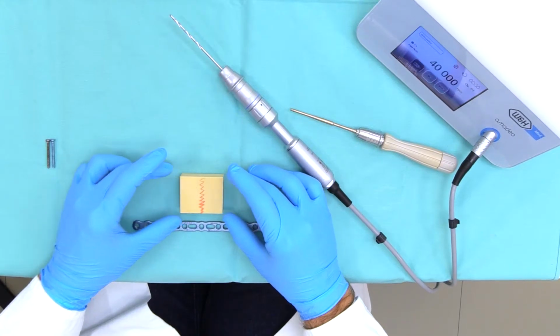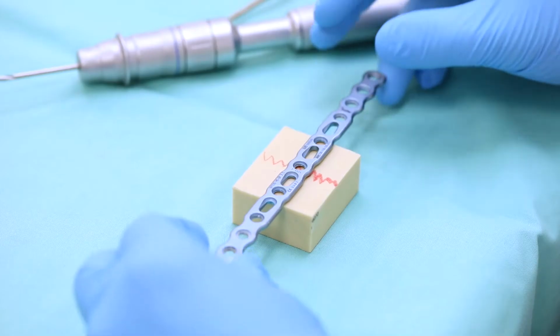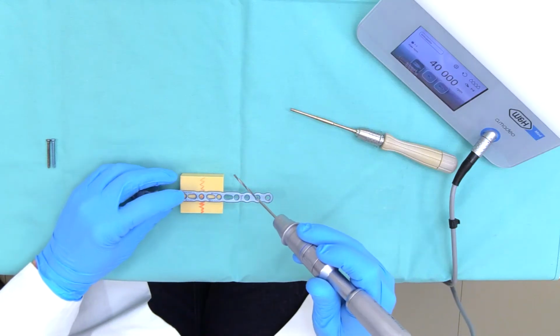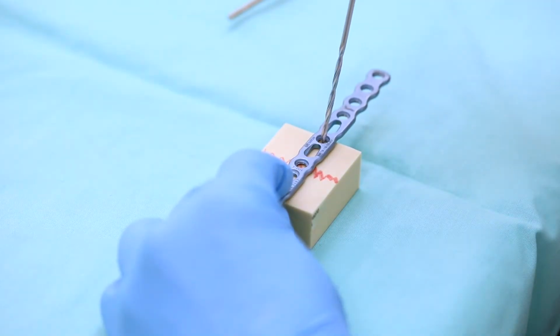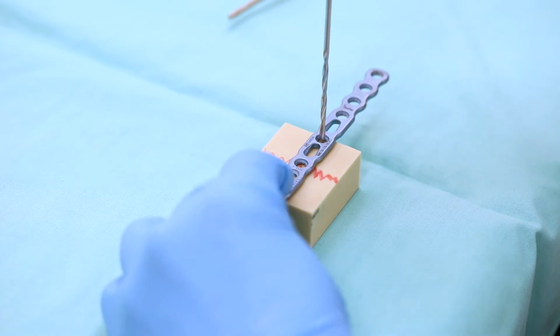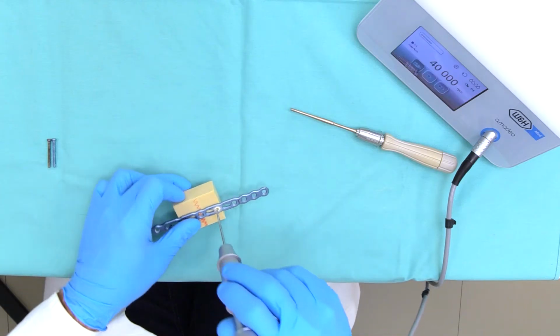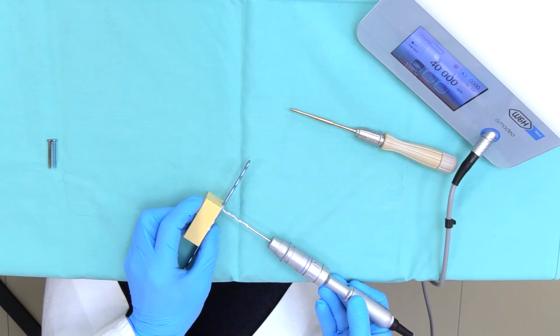After reduction of the fracture, a plate is attached on the bone. We now drill a hole for the screw. To get the right length of the screw, we have to check the distal part of the bone.